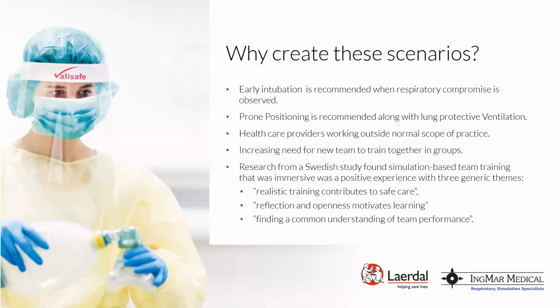Okay, so why are we creating these scenarios? There's a few reasons why we've created them that we've highlighted here for you. With all of the information about COVID-19 from around the world, there are some standards that have been established. The first one being early intubation when a patient's need for oxygen increases within a short period of time. As we have seen with the progression of this virus, this can happen within 12 hours of initial supplemental need for oxygen, typically 3 to 5 days after the onset of these symptoms.